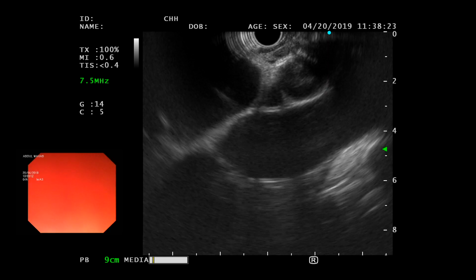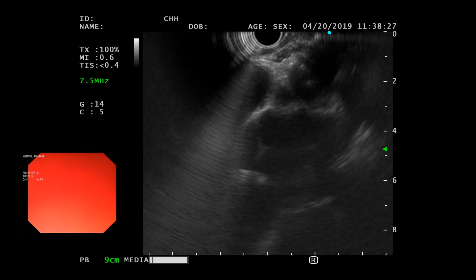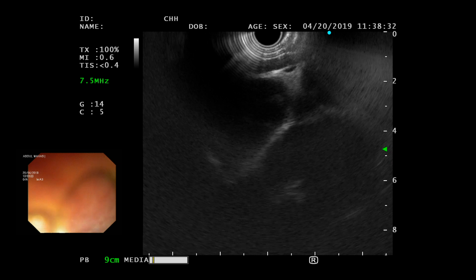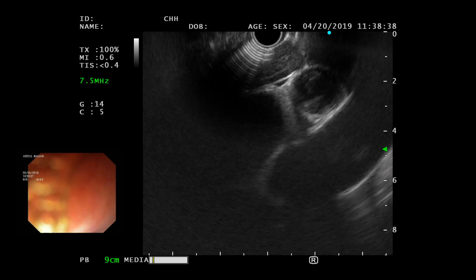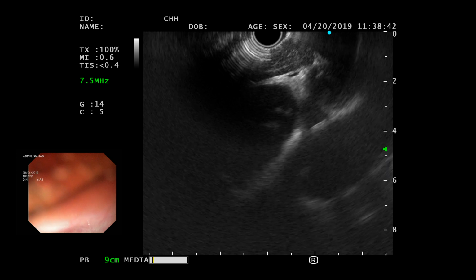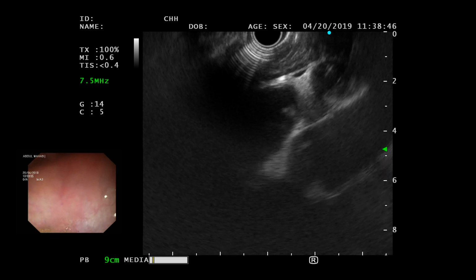See what happens when your big wheel is close to you or towards you. See what happens to that lymph node. Now let go of your big wheel and take your air out. And we have a big lymph node here in the subcarina. Yes. Appreciate it. Now this guy has lost weight as well, and it's a significant lymph node there. Would you agree with that?